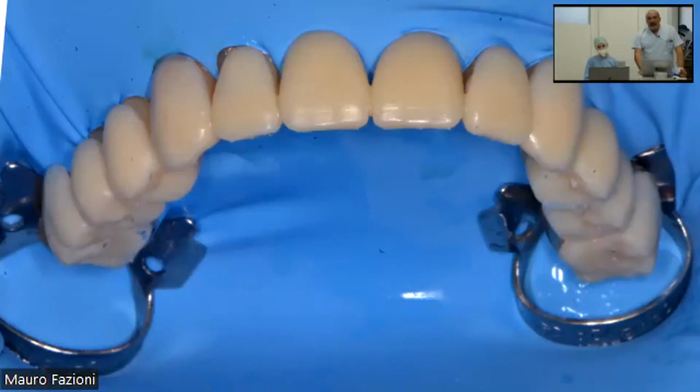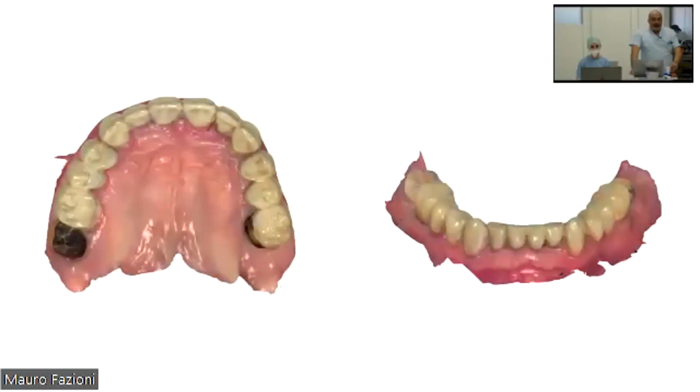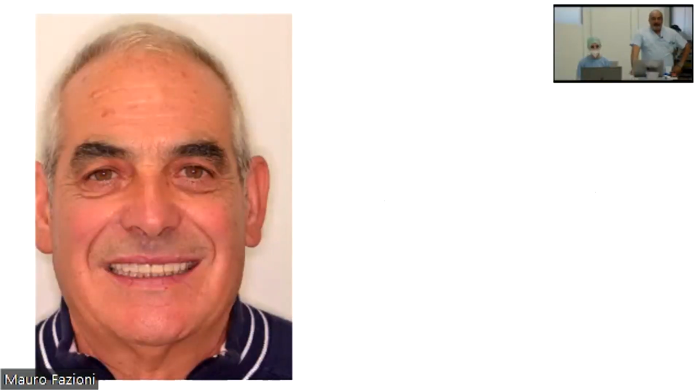And here is the final cementation. The final cementation is very important. First of all, we do not have to touch the patient's teeth. And second, we need adhesive cementation, because this is our bite. This bite gives the possibility and the safety for the patient using this kind of vertical augmentation. And after this, we can go polishing.